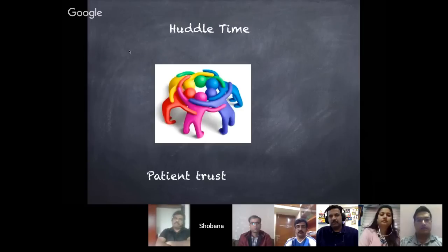Dr. X, your surgeon. We're here for an awake craniotomy for tumor resection, and this is a safety huddle. Can you please tell me your name and date of birth? Yes, my name is Mr. Y, and my date of birth is 22/2/2022. Are you sure about that? Yes. Okay. Can you tell us what we were doing for you today? You are going to have fun removing tumor from my left.